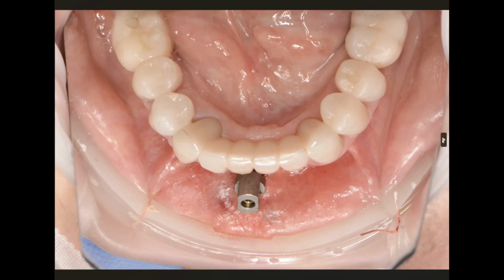Now, for me, I just scan this, I save it, I take off that scan body, I start my extractions, my incision line extractions, alveoloplasty, and all that, and we just go.